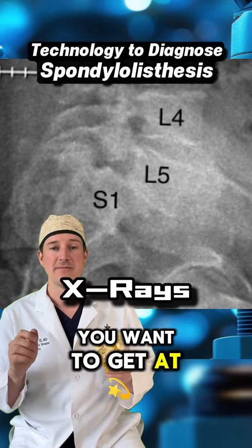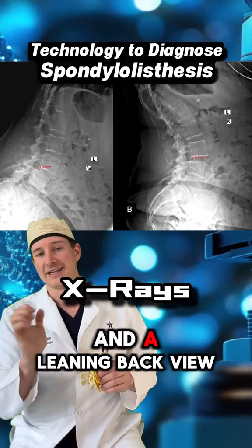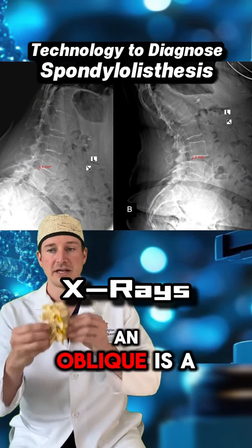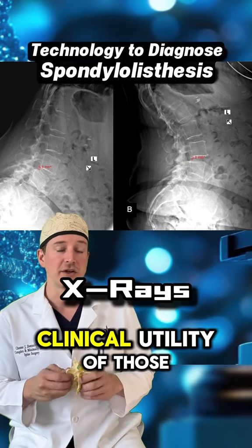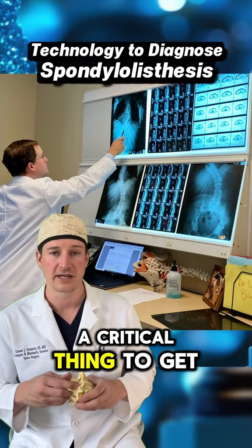You want to get, at minimum, a front view, a side view, a leaning forward view, and a leaning back view. Getting an oblique view, so instead of just being sideways, a little oblique, is a little debated in terms of the clinical utility of those. It definitely has some merit in some, but it's not a critical thing to get.